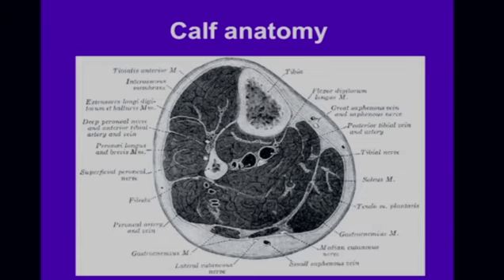So the calf can be examined. Typically, we look at the posterior tibial and peroneal veins from the ankle to the knee. Some technologists scan from the ankle to the knee to see it at the ankle easier, and then scan in the knee, where it can be more difficult depending on the size of the knee and the size of the muscle. We also look at areas of symptomatic pain, and we try to get some pictures of the gastrocnemius and soleal vessels that also lie within the plane of the image when you're looking for the posterior tibial and peroneal veins.